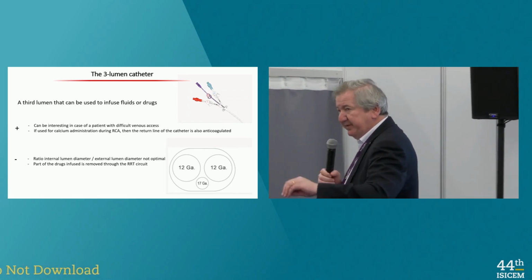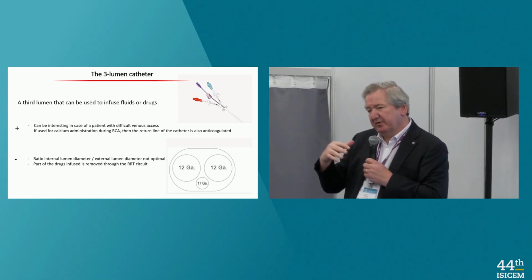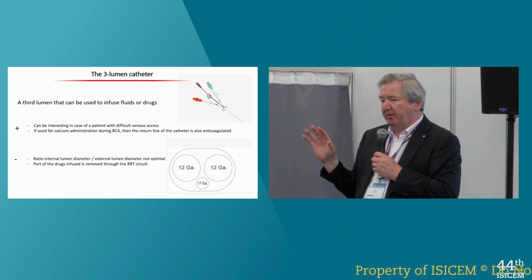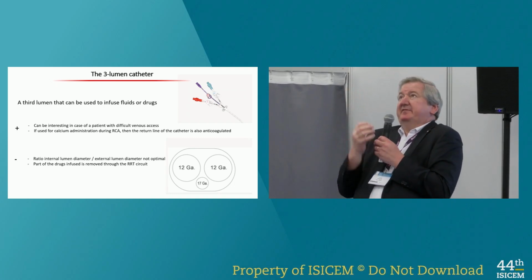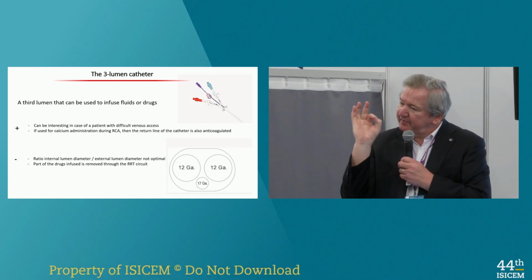But this has been done for 15 years in the chronic dialysis setting. I'm also a nephrologist. So, as Thomas said, the flow is so huge, no problem. And you are in the large cavity in the body. That's wonderful. I haven't said 7 centimeters. I said 2 to 3 centimeters, soft one.